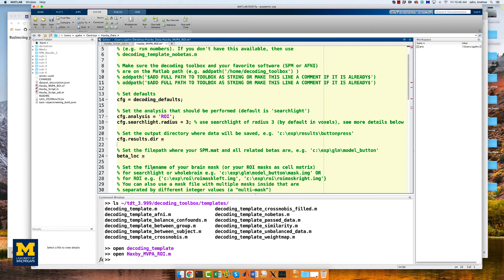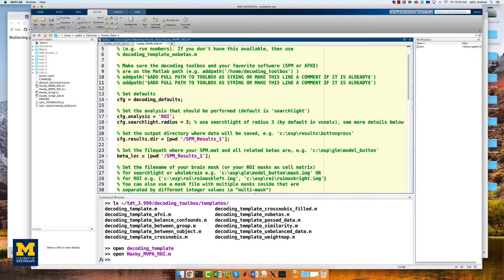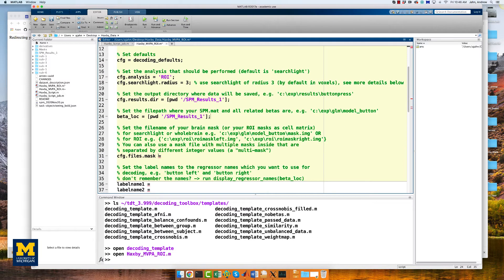On lines 21 and 24, config.results.dir and beta_loc can both be set to pwd/SPM_Results_1. Remember that this is the same file that contains the output from the preprocessing and the model estimation.